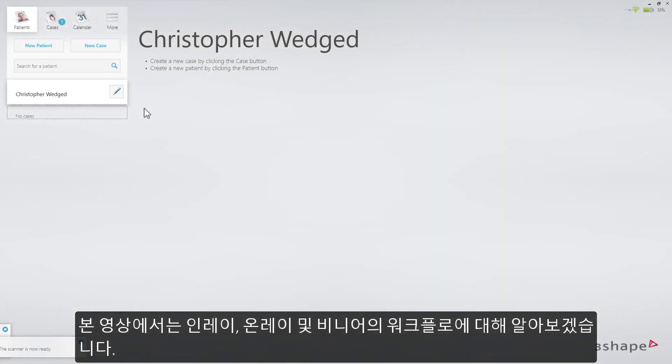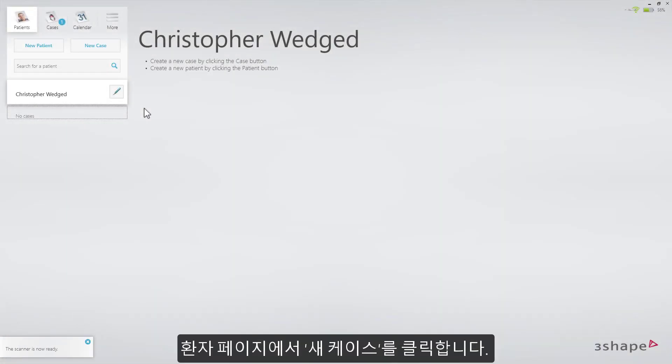This video will demonstrate the workflow for an inlay, onlay, and veneer. On the patient's page, click New Case.